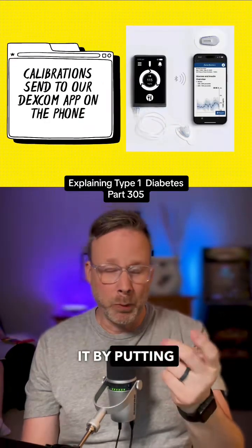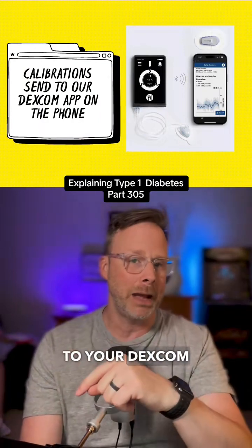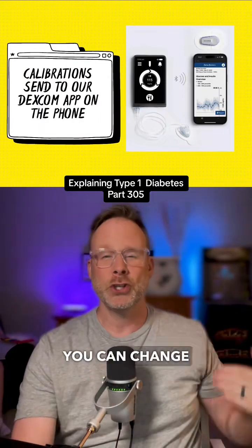You can calibrate it by putting a finger stick into it, and that calibration sends it to your Dexcom app right on your phone. And you can change it.